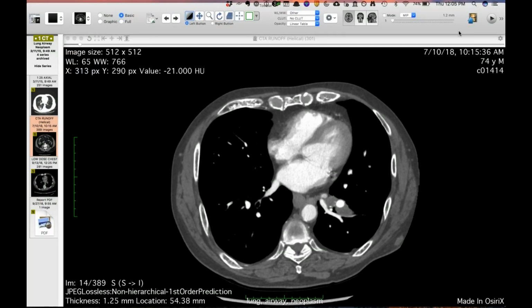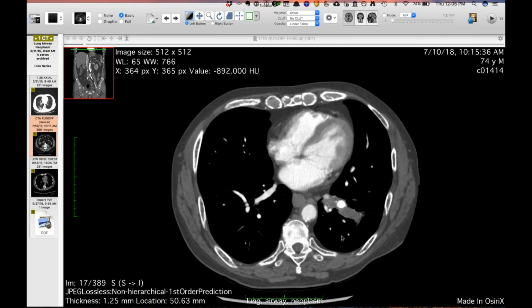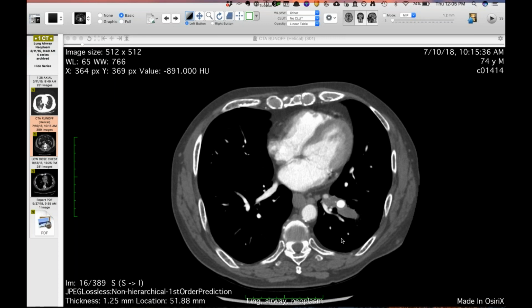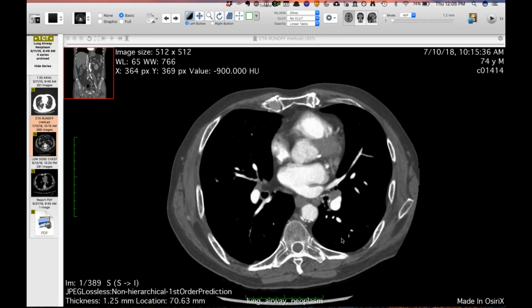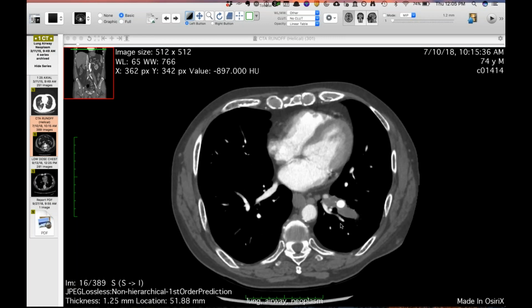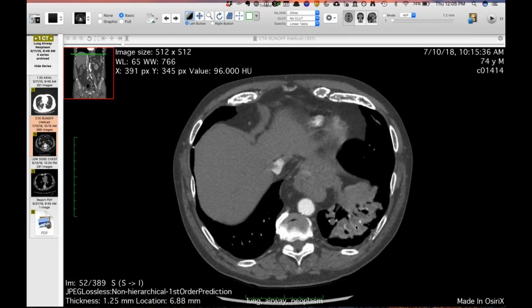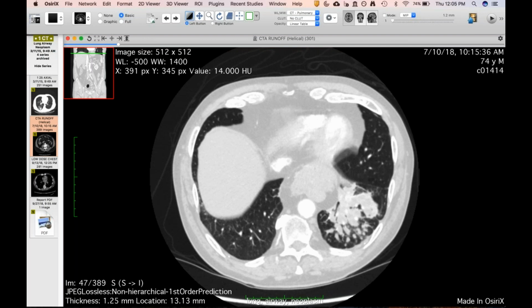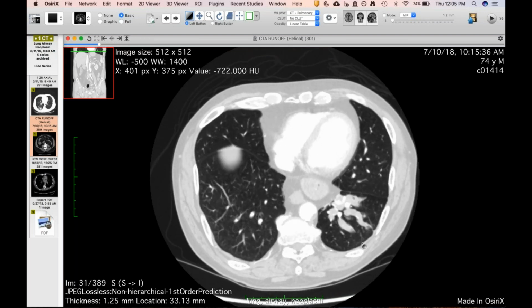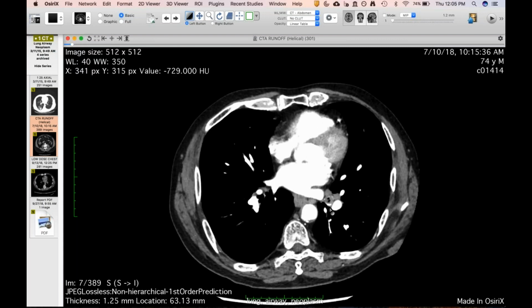Okay, do you see a CT scan? Yeah. Good. Okay. 74-year-old man. This is a patient at the VA, and this was a runoff or some sort of CTA of the lower abdomen, pelvis, and lower extremities. I don't know what the symptoms were, but they noted in his left lower lobe, this is as high as we go, that there's cut off of the bronchus and a bunch of mucus, pus, something filled bronchi that you can see dilated here and radiating out into the left lower lobe. And so this was as far proximal as they imaged.